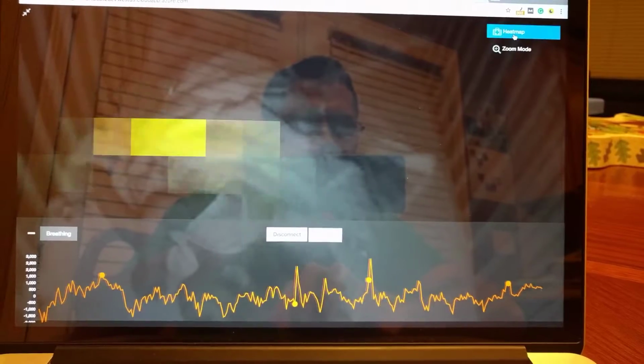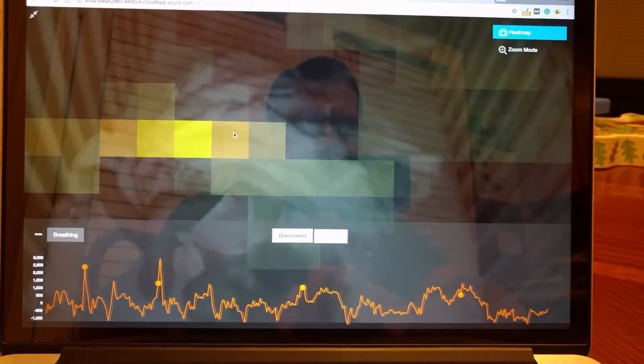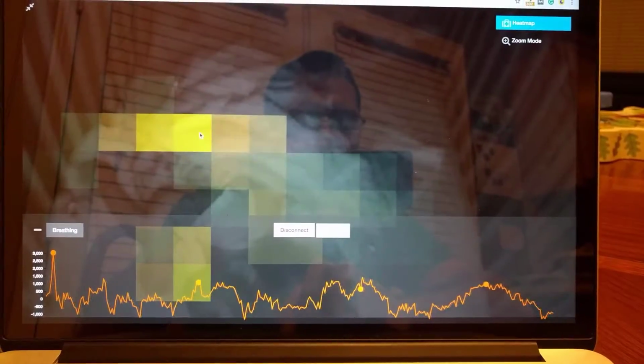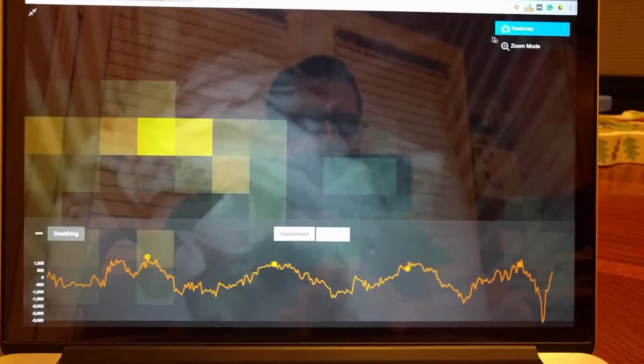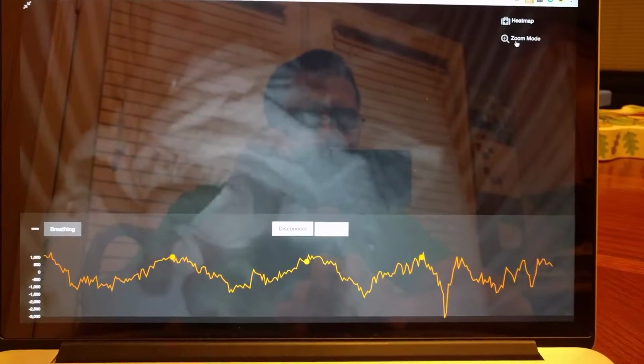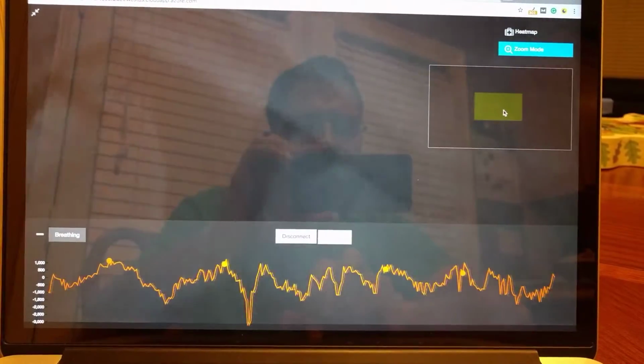But this does look pretty noisy, so I'm going to show you this heat map. It's kind of experimental, but it should be highlighting the area where we see breathing occurring. So it's kind of there on her abdomen, but it looks like it's not doing a super great job right now. So this is where you can actually zoom in and find.